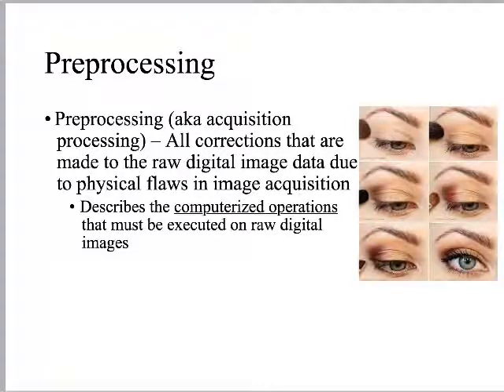and it's ways that we can correct the picture for our own way of viewing things, right? It should be pointed out, though, that almost everything that we can do in post-processing is stuff that the computer does during pre-processing. So the operations are the same, it's just who's doing it. Pre-processing, it's the computer, it's much more in-depth. Post-processing, it's the user, and it's much quicker. Or it's not as in-depth, I should say.